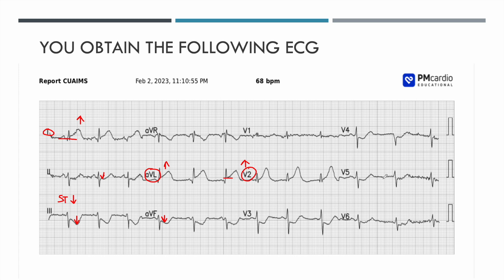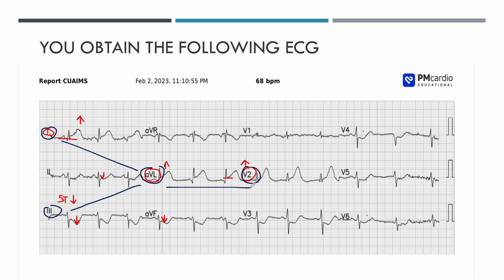V4, V5, and V6 all have a little bit of depression. But I want to focus primarily on what we're finding in leads 1, 3, AVL, and V2. You can see that these findings, if we superimpose on top of them, they kind of make a Y — like a Y on its side. So we've got elevation in lead 1, elevation in AVL, elevation in V2, and the most pronounced depression in lead 3.